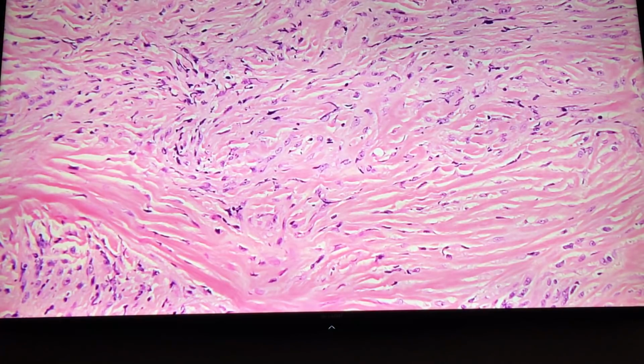It's very, very bland cytologically. So all of this is actually malignant. And this is actually biphasic because it has an epithelioid component. But you saw in the previous case, the sarcomatoid looks like a sarcoma. It's clearly malignant. This is a very bland, cytologically bland tumor that infiltrates the chest wall, does exactly the same things as any other mesothelioma, but it looks super bland.